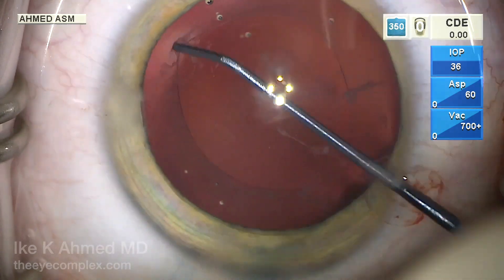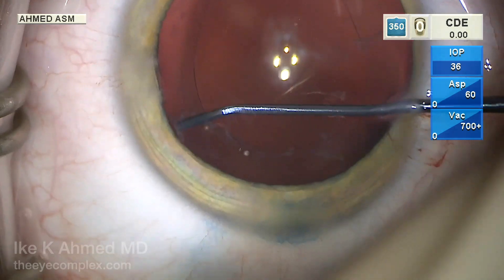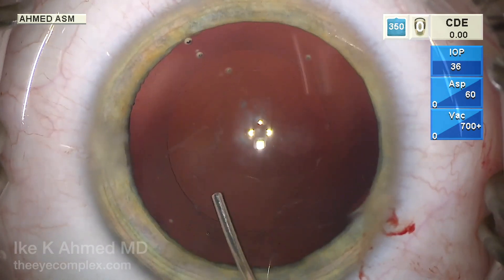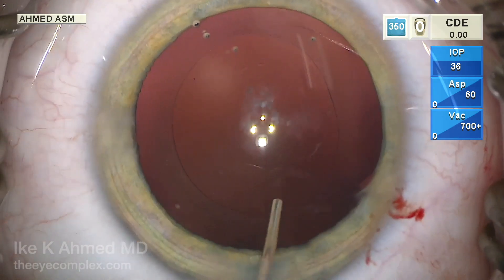This is a double-armed instrument with a bend, and with this beveled tip it allows us to remove the lens epithelial cells quite efficiently. We will then irrigate out those LECs, as well as irrigate the posterior capsule to remove any cells that may be present on the capsule itself.